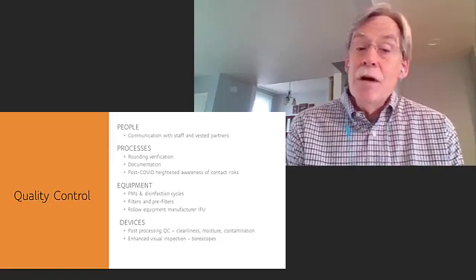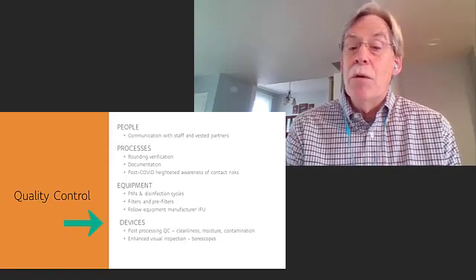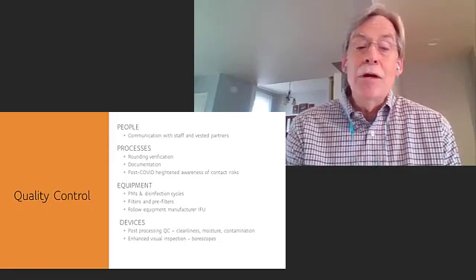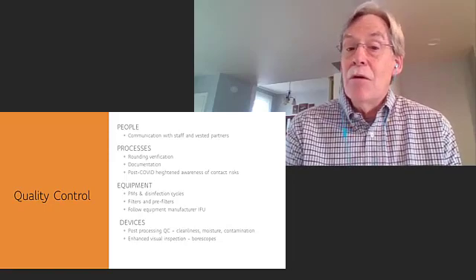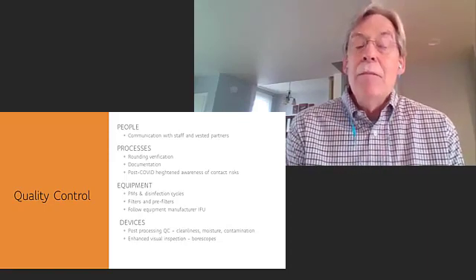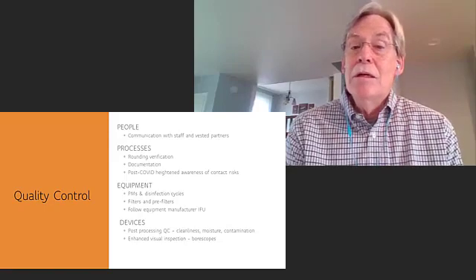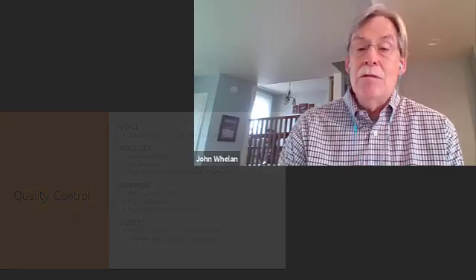And then for devices, make sure your devices are truly patient-ready before you reopen or ramp up. Make sure that packaging or storage hasn't been breached. For endoscopes in storage, did the shutdown create a situation where the scopes have now exceeded your institution's hang time policy? Make sure you've reinstituted best practices for inspection, cleaning verification, and surveillance as per your policies.